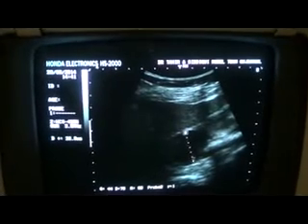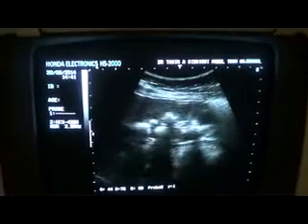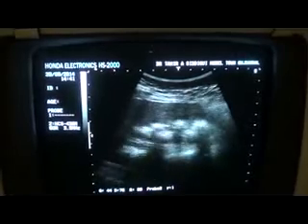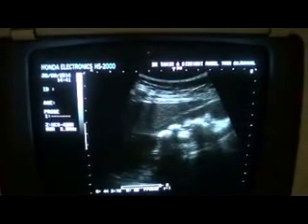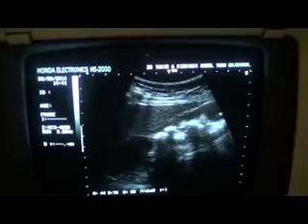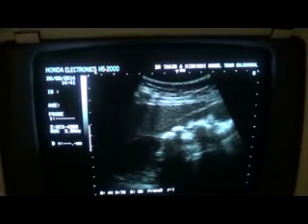We are evaluating the right kidney in a longitudinal section. Now, the cyst at the upper pole measures 32 millimeters, and the rest of the medullary region is occupied by dense, coarse, echogenic areas. This is the cyst at the upper pole, and this is the smaller cyst at the lower pole. No central sinus echocomplex is seen, and here you see a calcification.